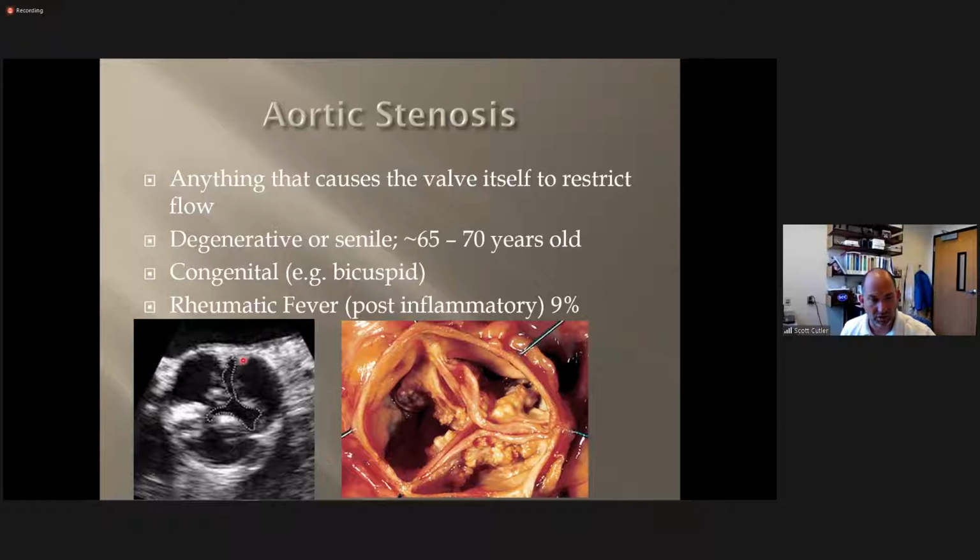So this is one way of tracing it. It is not the most accurate way because calcifications, as we know, cause shadows and dropouts, and we don't necessarily know exactly where that line is. Therefore, our Doppler information is actually better at determining actual valve size than a planimetry like this. And you may not always be able to get this exact slice at the thinnest portion of that. So there's a lot of tech error that may come into play if you're trying to measure something in this method, although technically it's an acceptable method. So if you've got nothing else to do and no other ways to prove it, and you can't do your Doppler for some reason, this gives you at least an idea of how big that valve area is.